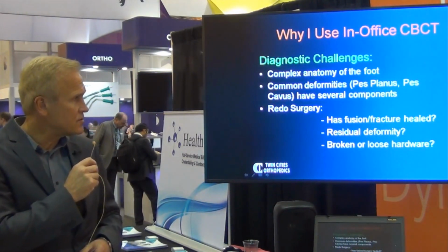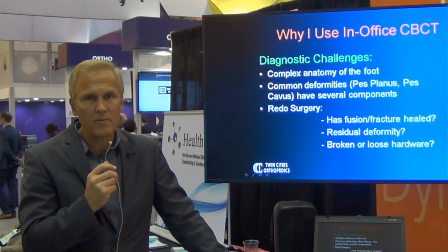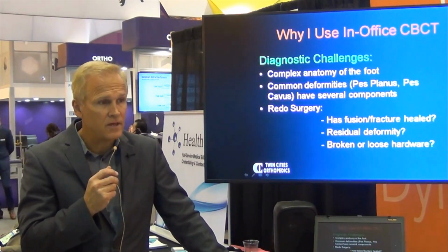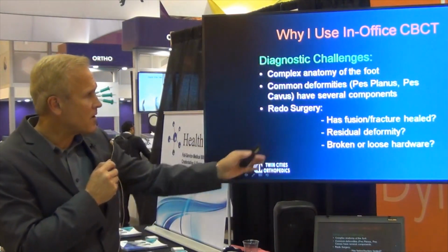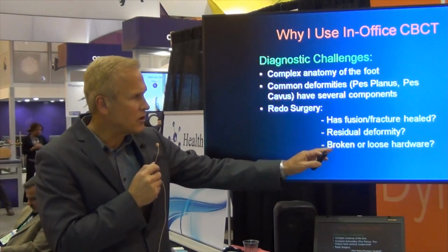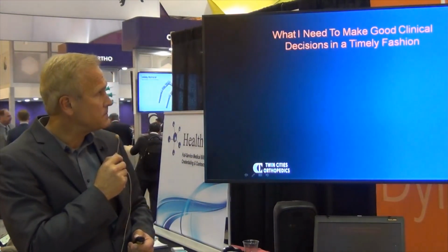We do a lot of redo surgery, and it helps us to know where the pain is coming from in people who've had surgery before. Again, with previous hardware that's been placed or previous attempted fusions, we don't know for sure whether the fusions have healed and if that's the source of the patient's persistent pain. So again, the CT scan is very important for this, especially the weight-bearing part, to see if there's any residual instability in some of those joints, residual deformity, or broken or loose hardware. It gives us a lot of detail to work through all that.